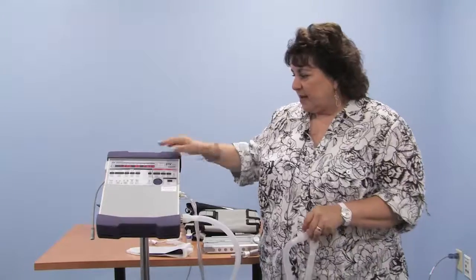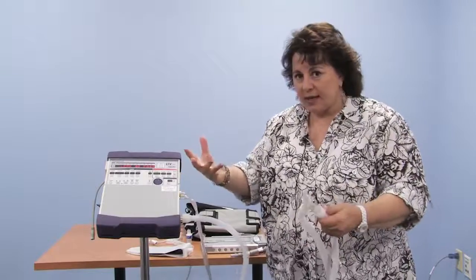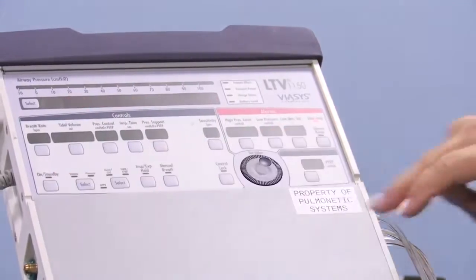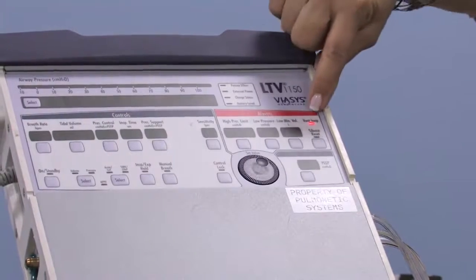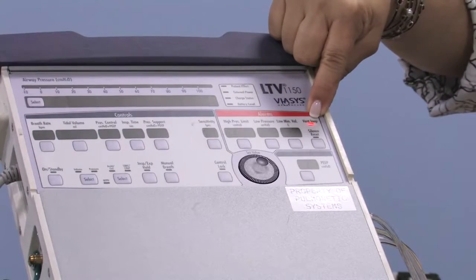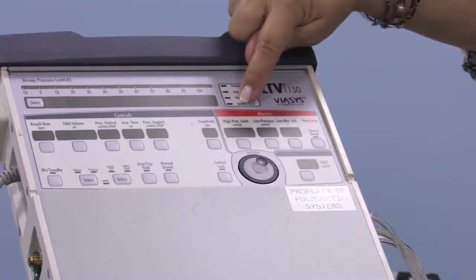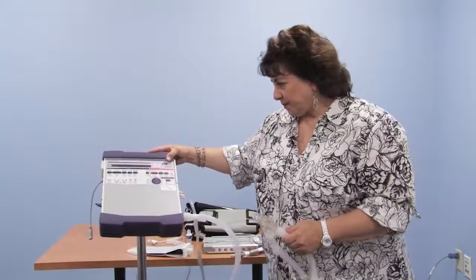And now we pass. We cannot put this on our child now. There's no flow. It's not on and running. So what I ask folks to do is just turn it off. Hold the button down, turn it off. Silence it, as you always need to do when you turn it off. This is normal for the vent in-op red light. It's in the manual. It's normal for this to be on for a few minutes after it's powered up, as well as the charge status light. When you plug it in, it determines whether it needs to send power to a battery source that's on it.